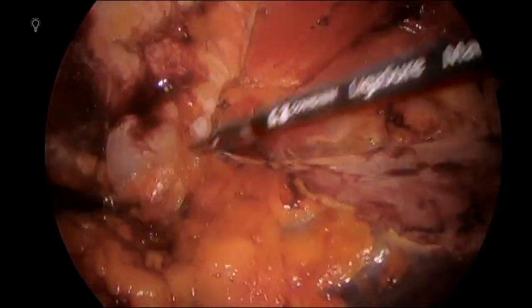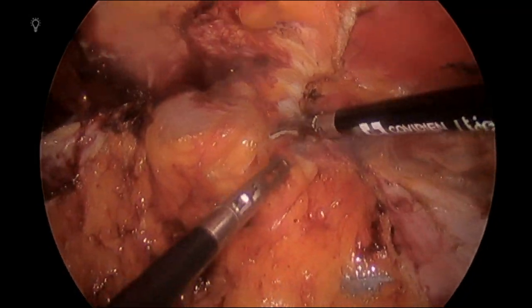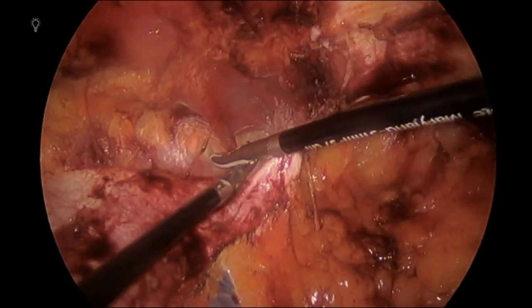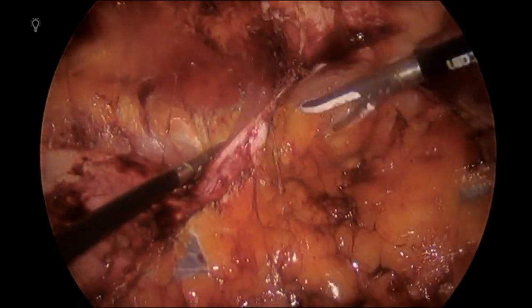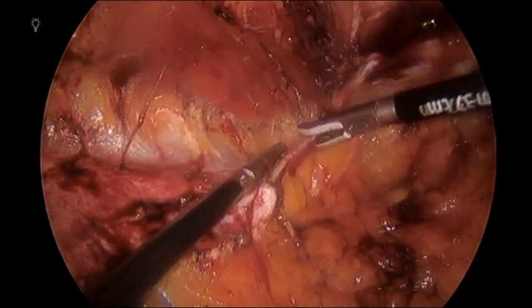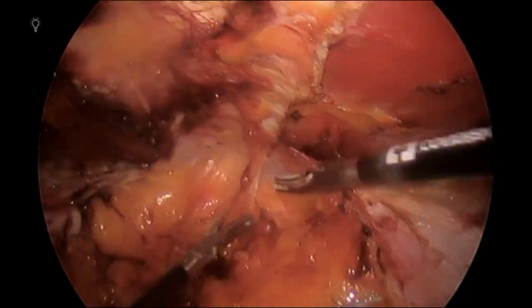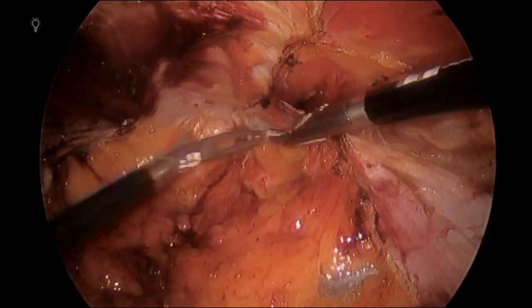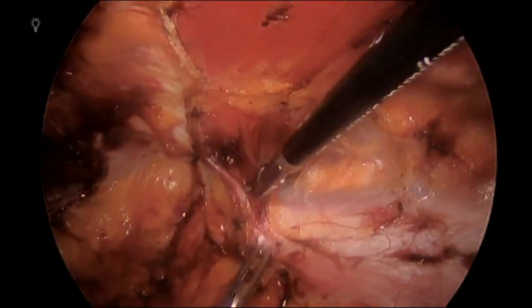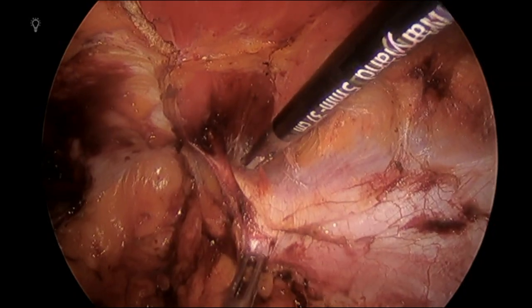Once I have done this dissection, I will check out my posterior sheath in the peritoneum to close all the peritoneal rims that I did. I continue my dissection a little bit further to get behind the xiphoid process and just above the costal margin.